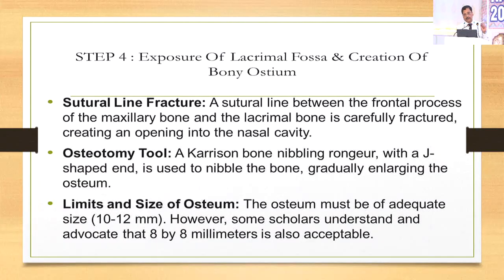So it will be very difficult to make a bony ostium in those people. So you may need different instruments like a drill for that. And this has been proved radiologically and anatomically also through various scientists.